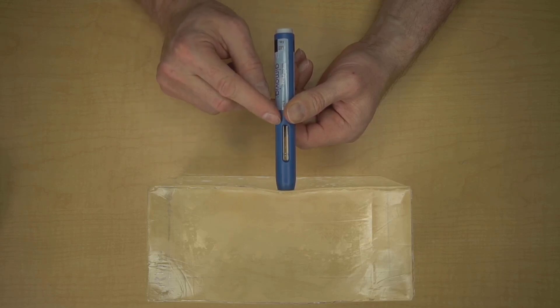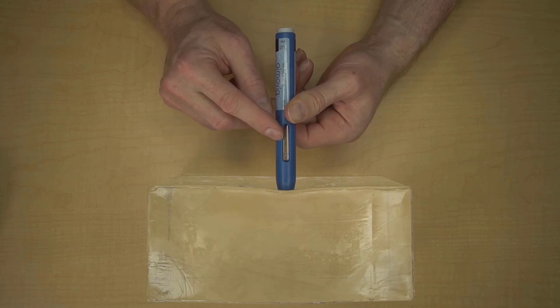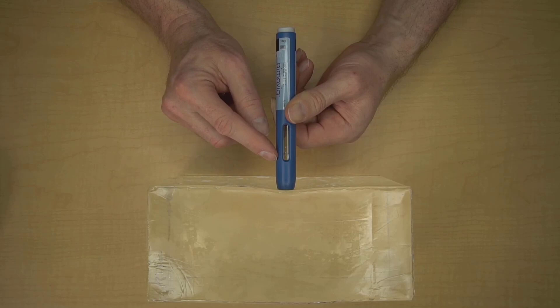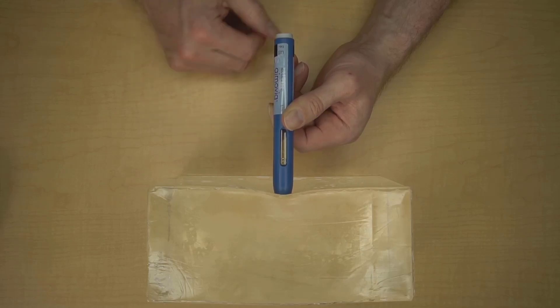The moment you press the start button, a spring will place a very fine needle about a quarter of an inch into your skin and will start the flow of medicine. You will be able to see the flow of medicine because a yellow bar will appear in this window, and it will take about 15 seconds. You should hear and feel a click when it's done. It's done. Let's take a look at exactly what happens now.